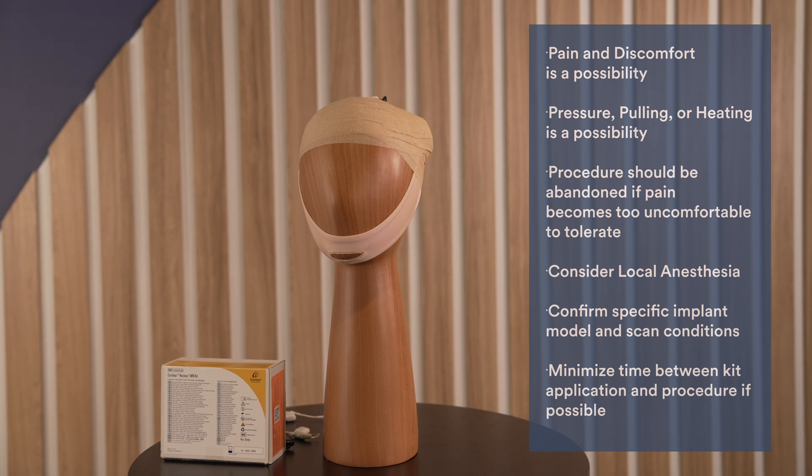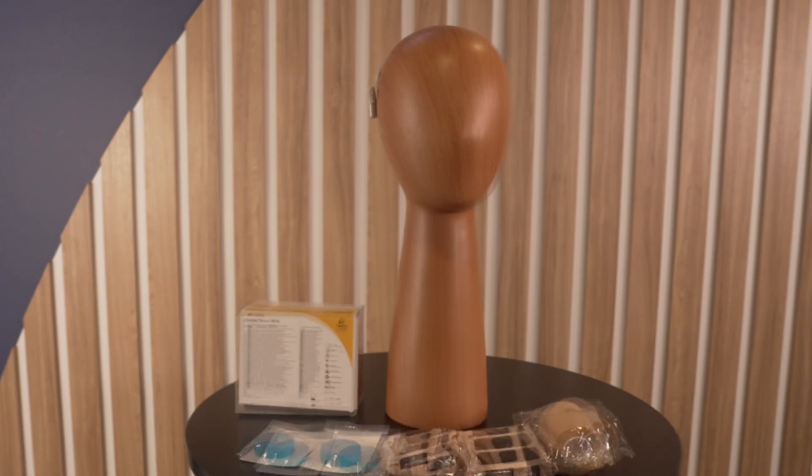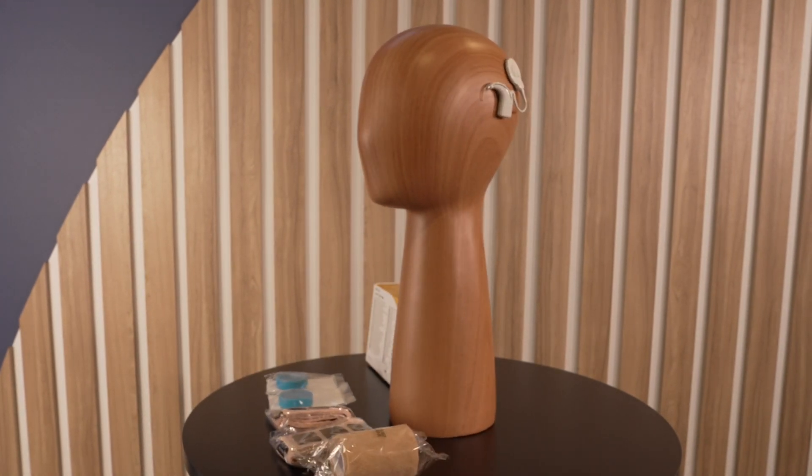Confirm the specific implant model and scanning conditions. If unsure, please contact Cochlear for this information. It is helpful to minimize the time between application of the kit and the MRI scan. Counseling about the procedure prior to sound processor removal is key, as the recipient will be unable to hear once removed.